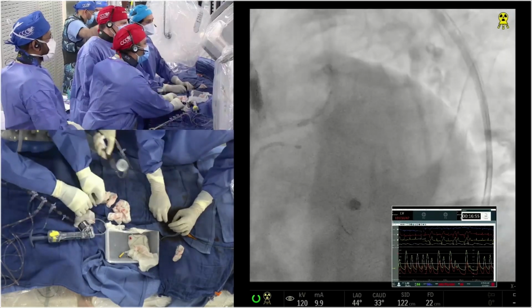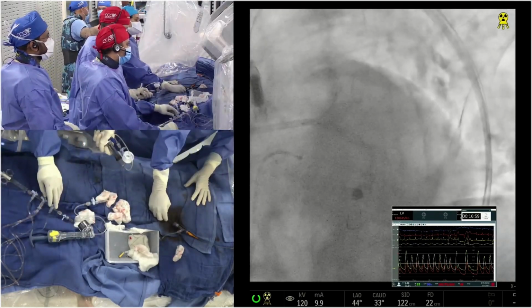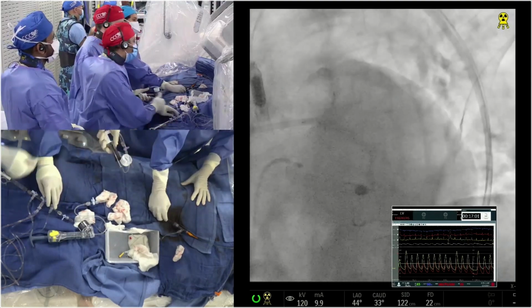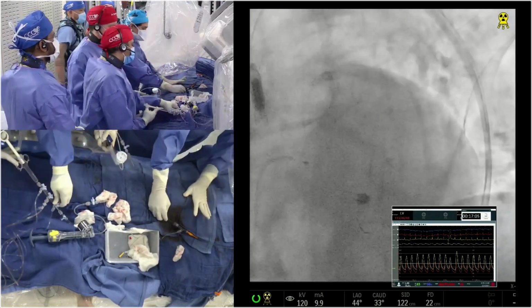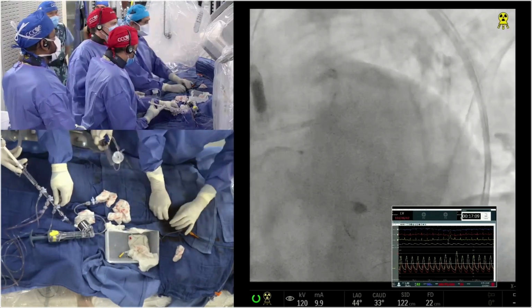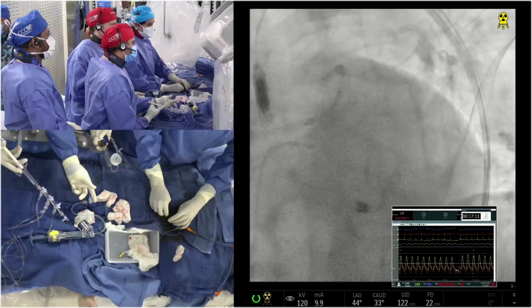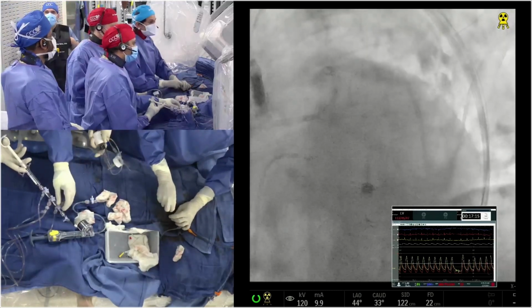So you can see here the mini crush technique. Andrew here can show the animation of the mini crush. Now again, can we do mini crush? We can do culotte. We can do DK crush. Anything where we all become proficient, master a technique, and keep doing the same technique.